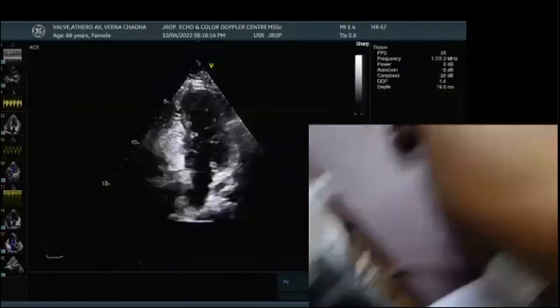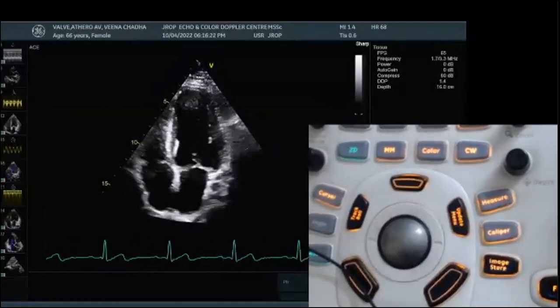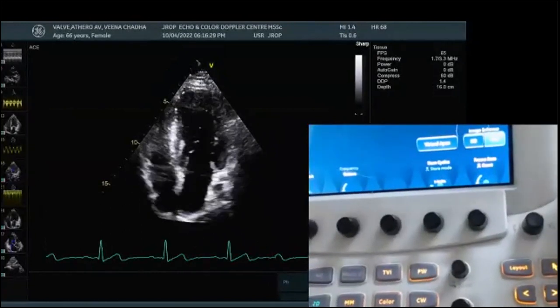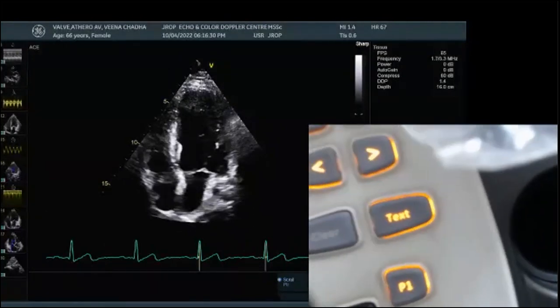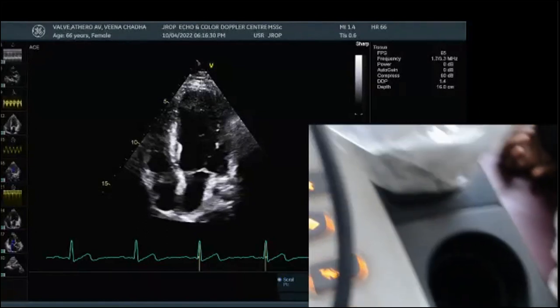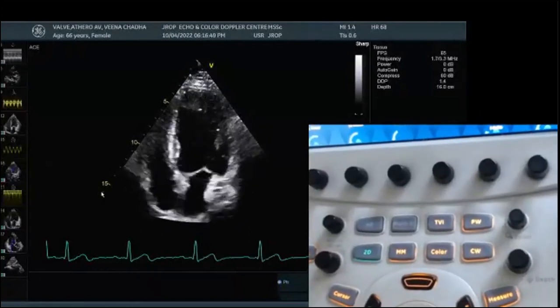Yes, sir. Sir, one more question. Go ahead. In this window, sir, sometimes we see 5, 10, 15 on the left side. What is the role of that? Great. What's your name? Jai Singh, sir. Jai Singh, you're an intelligent person. God bless you. Nobody asked me this question. I was wondering, nobody has asked me this. What is the role of this 5, 10, 15?